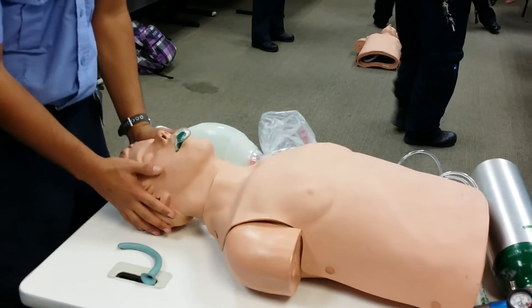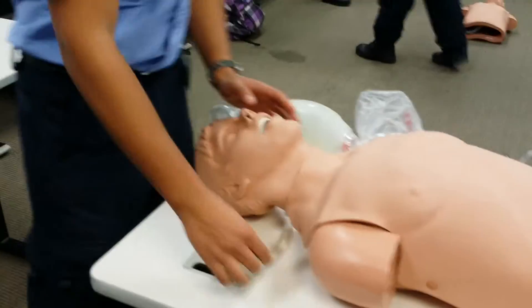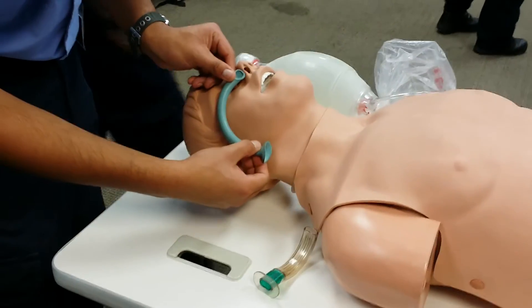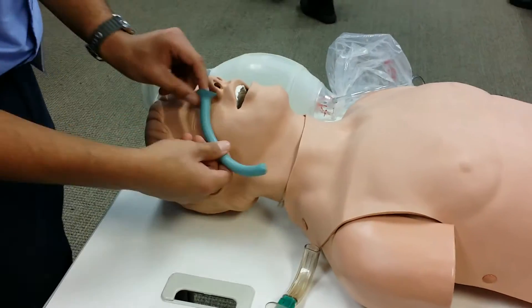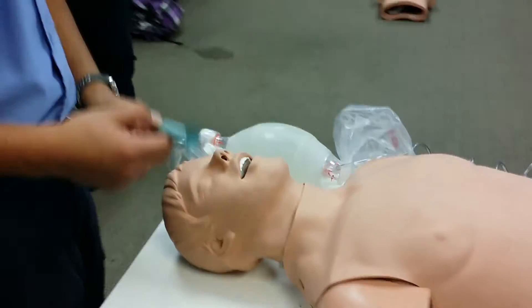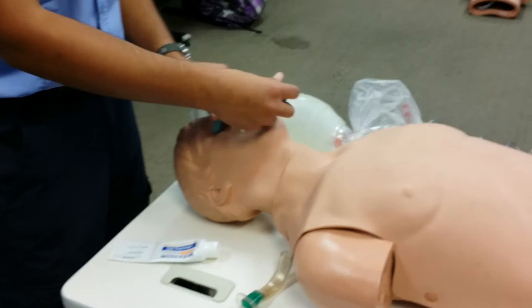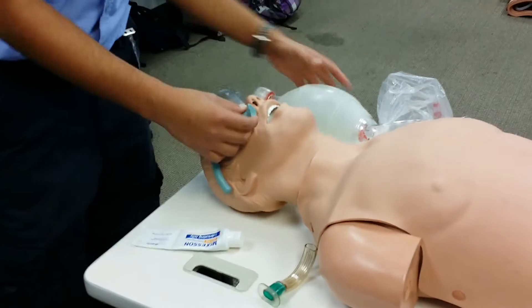Does he take the OPA? He gags on that, so now I'm going to go to the NPA. I'm going to measure it — side of the nose down to the ear. I'm going to want to get the lube, lube it, and place it in. Did he take it? He takes it.